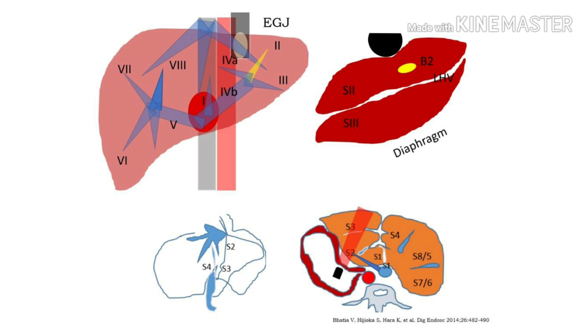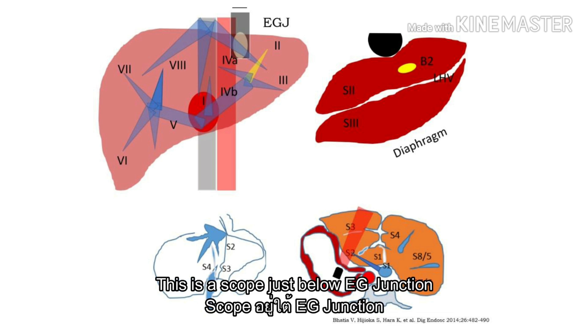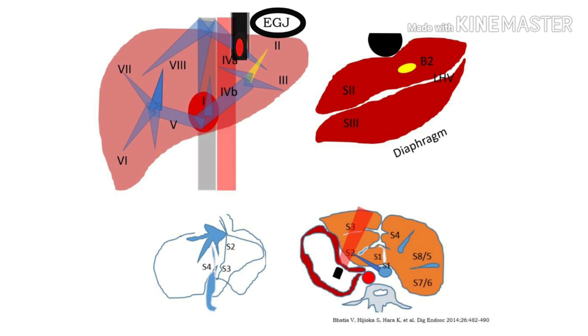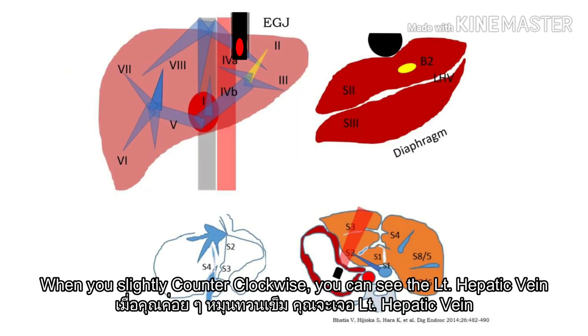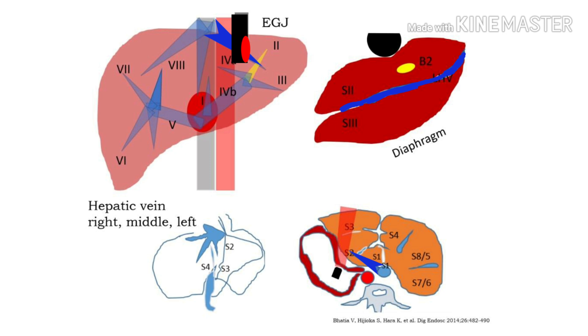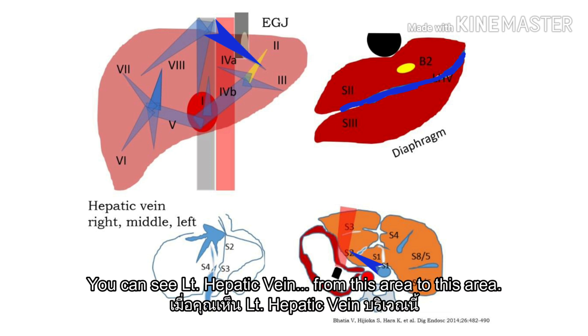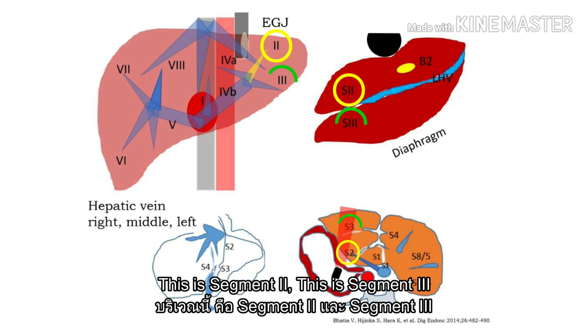Here, the liver. This is literature by Mr. Hara. This is a scope just below the xiphoid. You just slightly clockwise first. When you slightly clockwise, you can see the left hepatic vein. But from this area to this area — this is segment 2, this is segment 3.